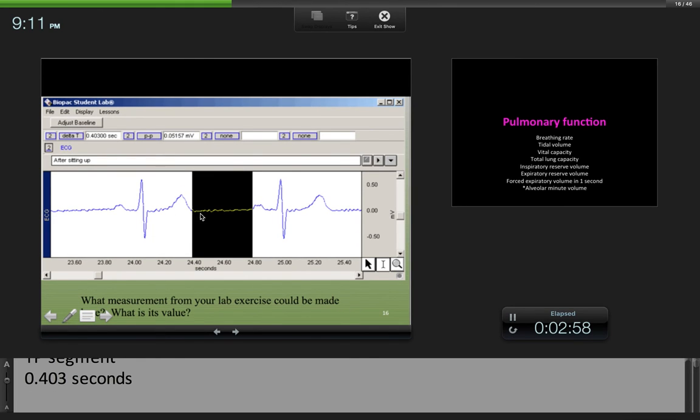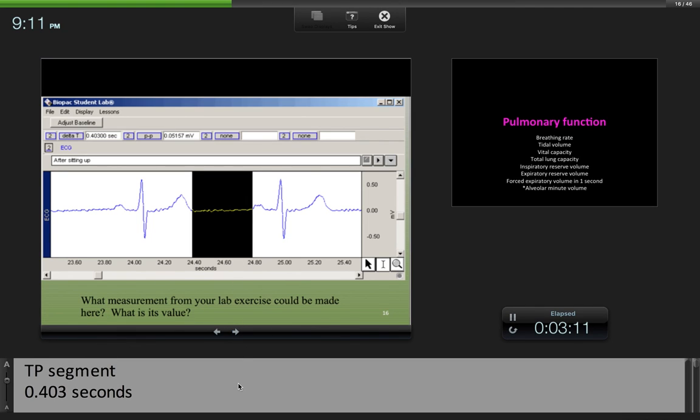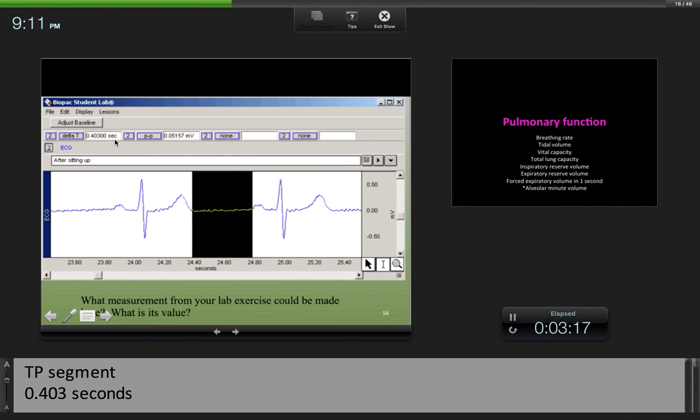Here we have a T wave and a P wave, so this is the TP segment. It's flat, it's a segment, and we're going to call that 0.403 seconds.